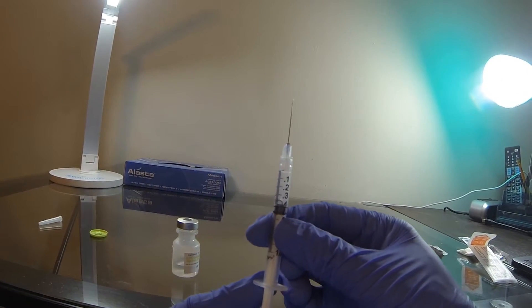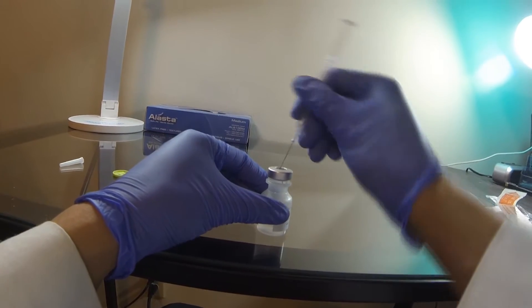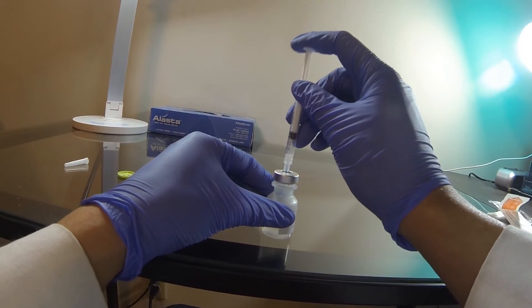Once the top of the bottle is dry, hold the syringe bevel side up. Attack initially at a 45 degree angle, and when you make contact, rotate to 90 degrees, insert the needle, and then push in the volume of air.